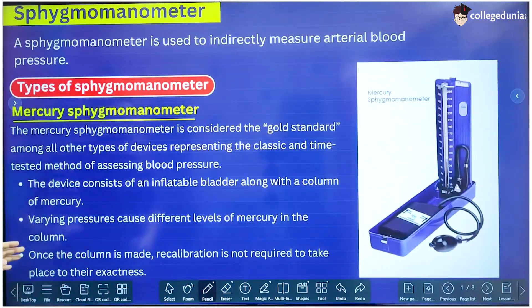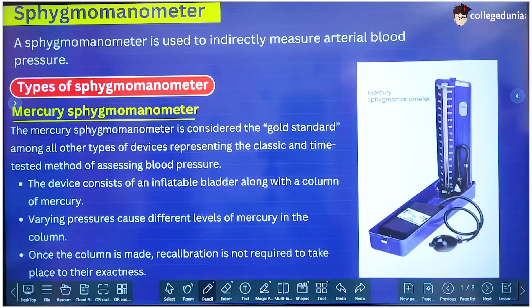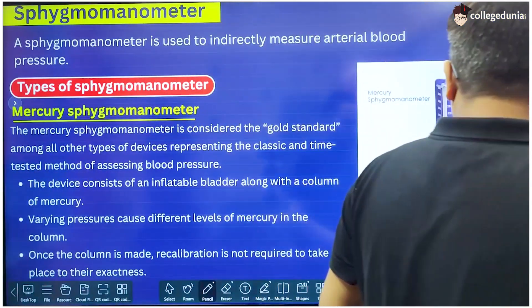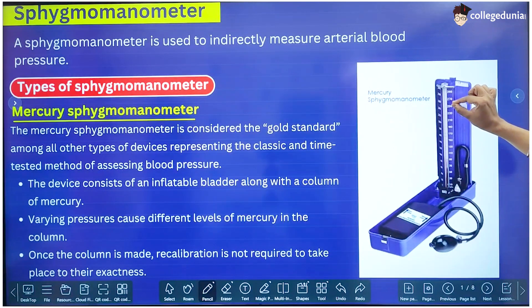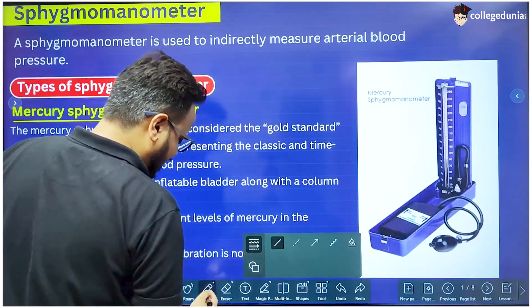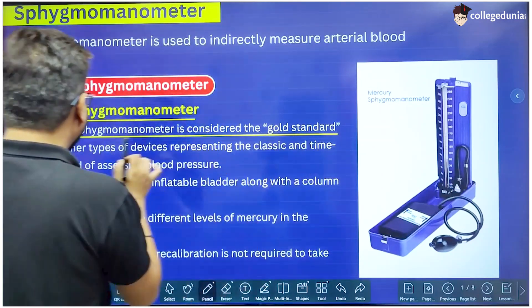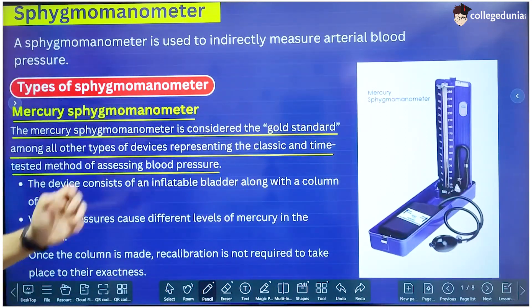First, we will study the various types of Sphygmomanometer. The first one is the Mercury Sphygmomanometer. You all must have seen this with a doctor. This is one of the most common Sphygmomanometers used to monitor blood pressure. It is called the Mercury Sphygmomanometer because the pressure is measured using a mercury column. The height of the mercury in this column gives the pressure. This is the most accurate Sphygmomanometer of all devices present, so it is treated as the gold standard.